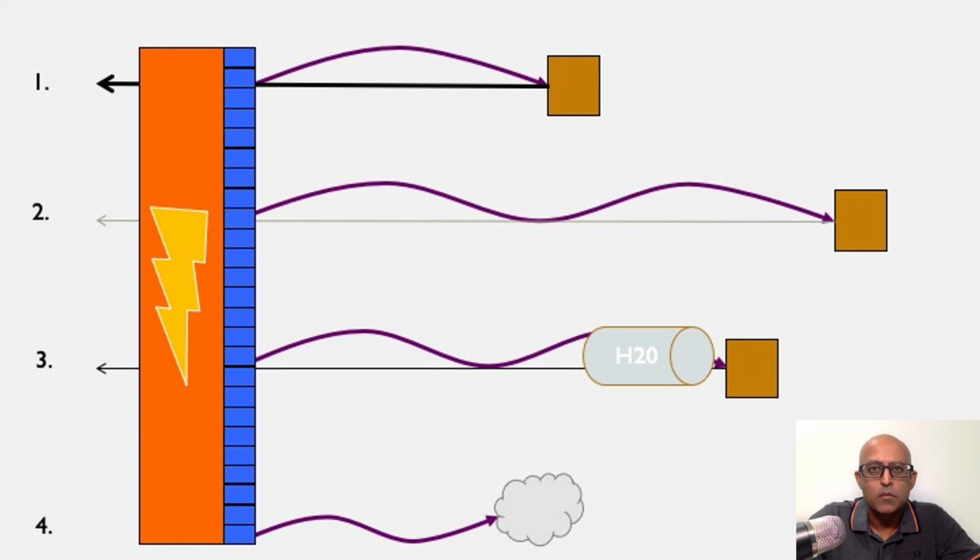The image that we see will depend on the depth of the structure that we're examining, the nature of the structure, and also the type of interface that the sound waves are encountering.